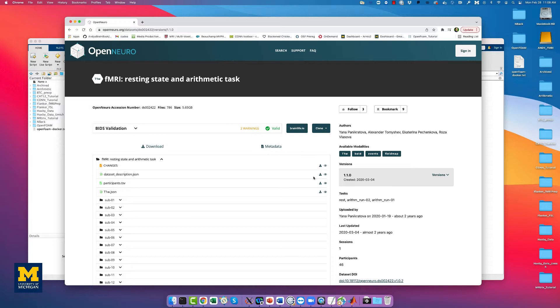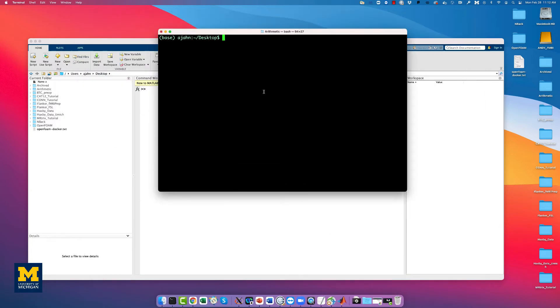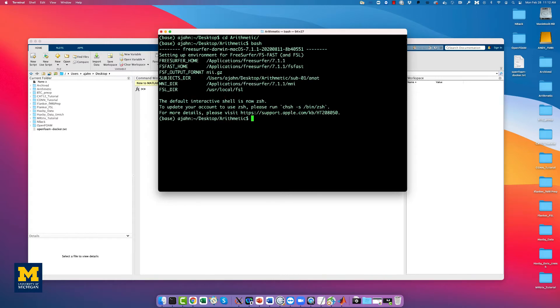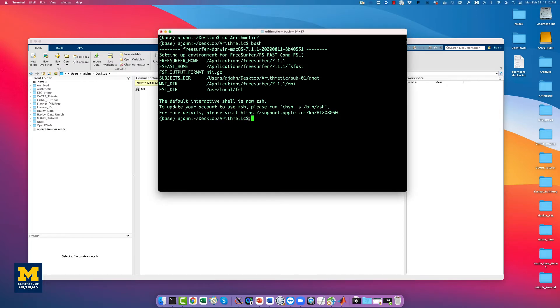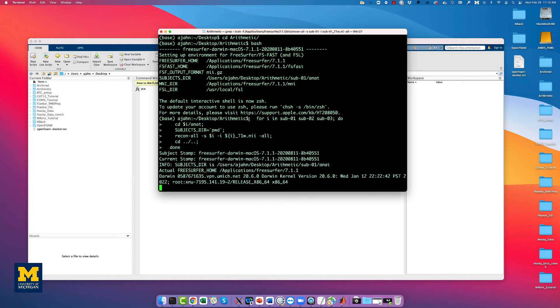If you followed the steps in the previous chapters, you should have the entire dataset downloaded. Use a terminal to navigate to the folder 'arithmetic', which in my case is in my desktop directory. Make sure you are in a bash shell, and then type the following code, which you can copy and paste from the more info box below. This will run recon-all sequentially in each Anat directory. More efficient ways of doing this can be found in the links to the chapters below, but this will work for most people.